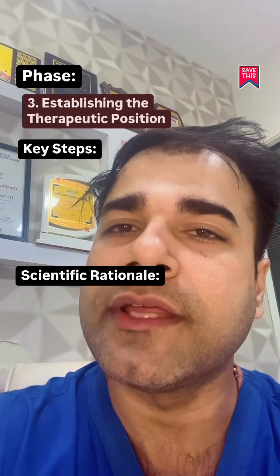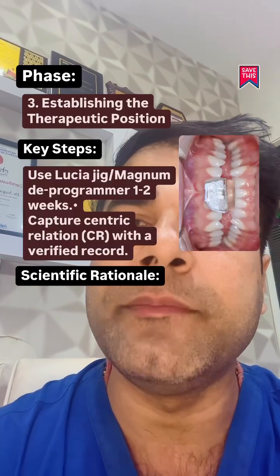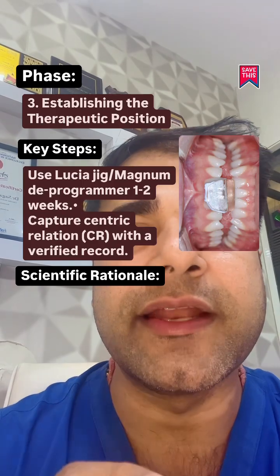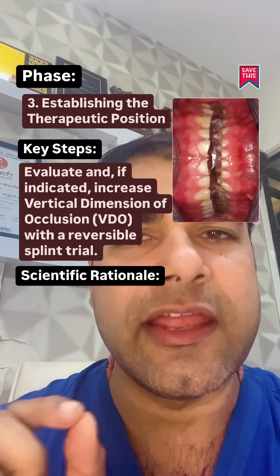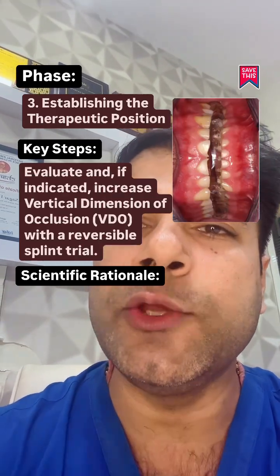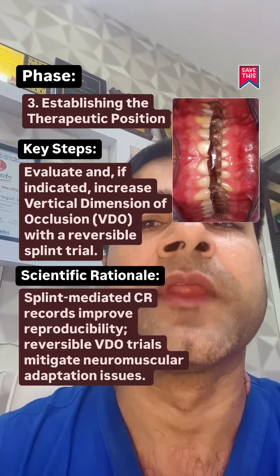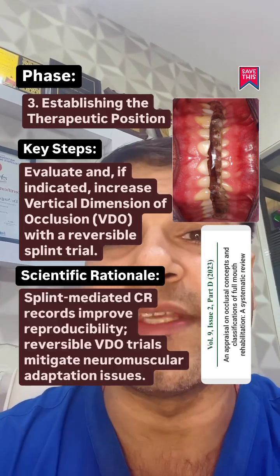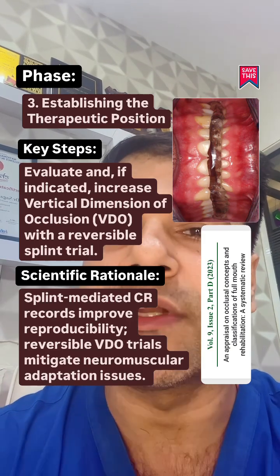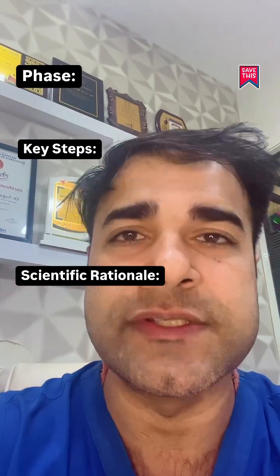Establishing the therapeutic position: use a Lucia jig or Kois deprogrammer for 1–2 weeks to capture centric relation with a verified record. Evaluate and, if indicated, increase the VDO with a reversible splint trial. Splint-mediated CR records improve reproducibility, and reversible VDO trials mitigate neuromuscular adaptation issues.